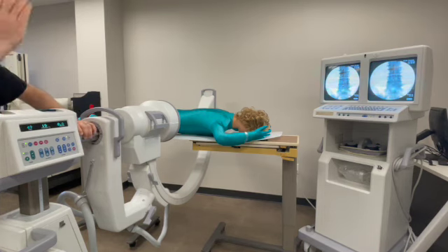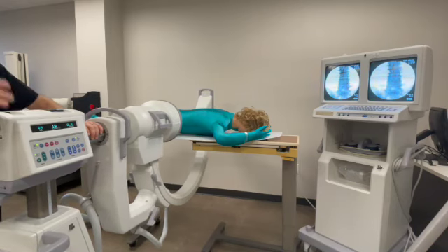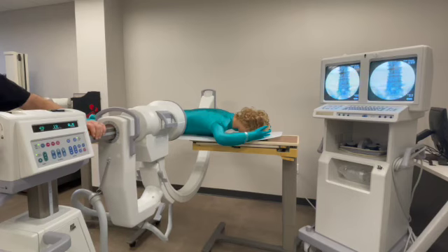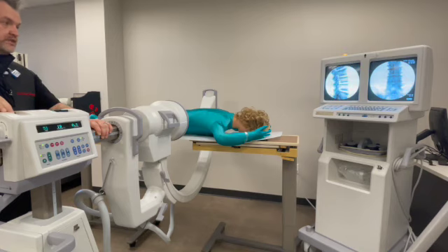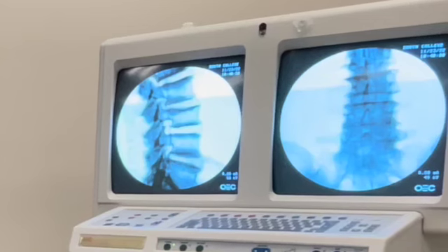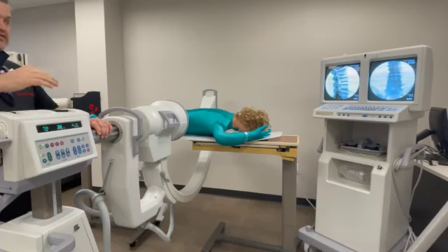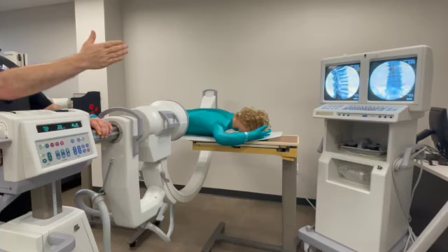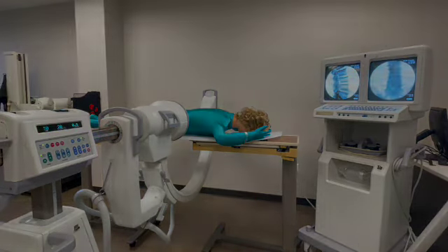Now to compensate for that leaning left, I'm going to wag my machine left. I'll also need to slide the machine a little bit north to compensate. When I take that image, hopefully I should get superimposed endplates — and there we go. Two images and two useful images, because now for the physician I have a starting PA and also a perfectly lined up starting lateral.